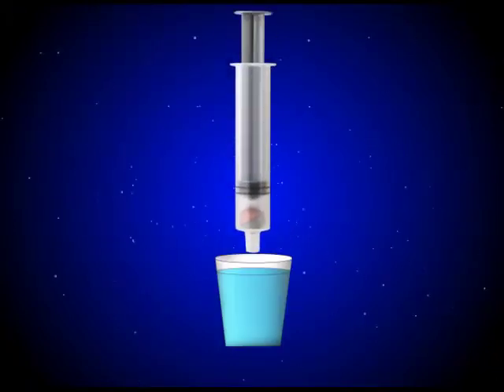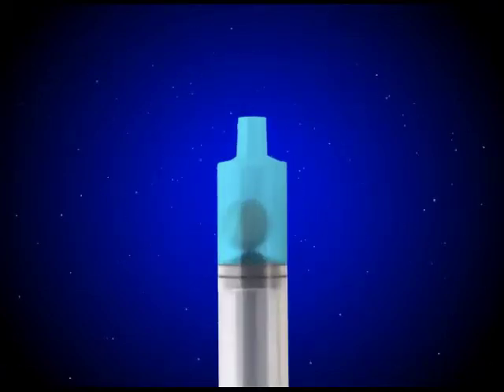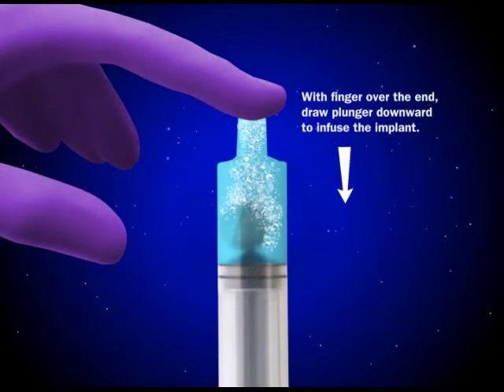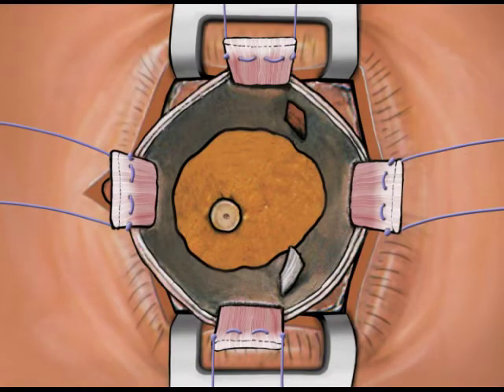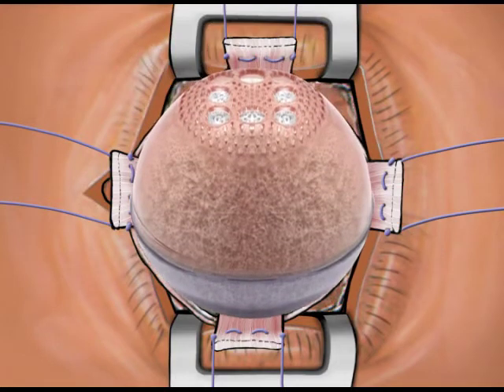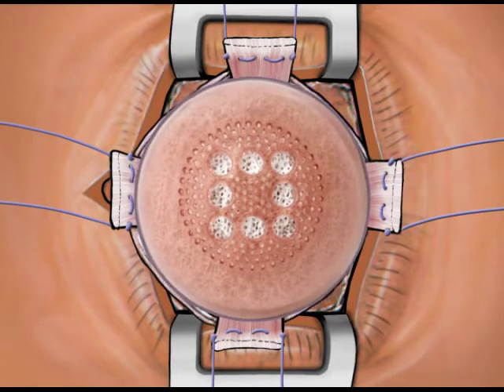Next, prepare the chosen implant by infusing it with an antibiotic and local anesthetic solution. With finger over the end, draw the plunger downward to infuse the implant. The implant is placed deep into the orbit after the larger sizing sphere is removed. Because the implant is completely smooth, it will slide deep into the orbit as easily as a silicone or an acrylic sphere.